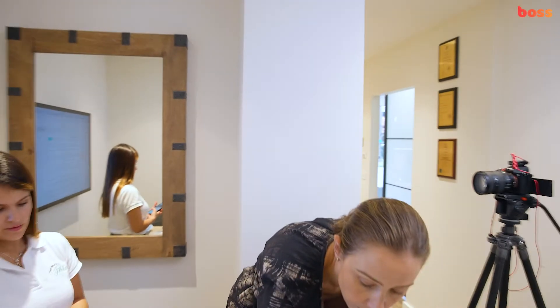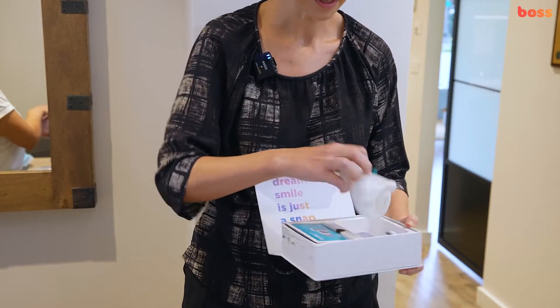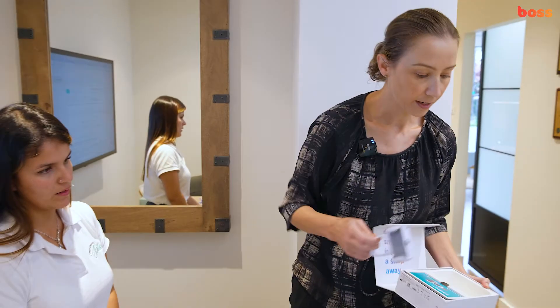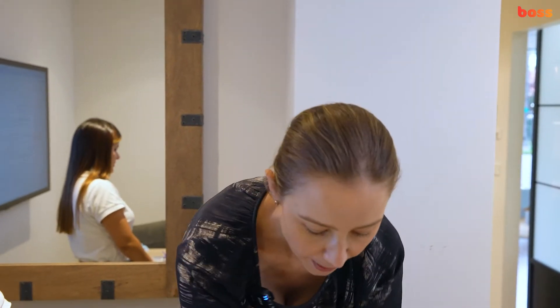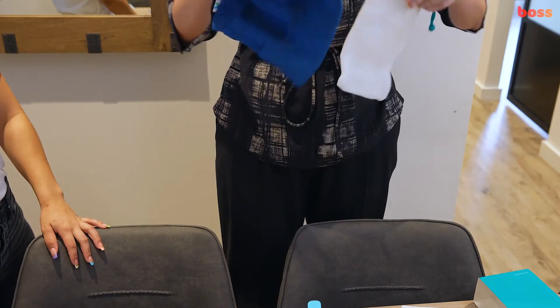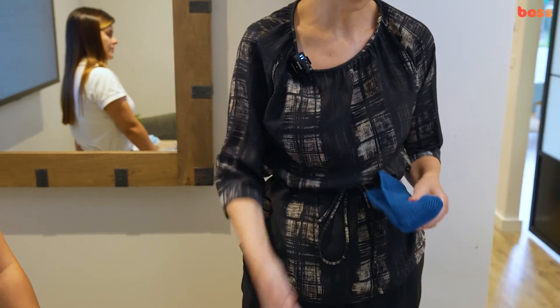I just wanted to show you what this particular scan box looks like — this is a new version. It's nice, small, and very compact. You can now see the difference in size: that's the original scan box and that's the new scan box. Even the packaging shows how much smaller it is. We've had a few patients and practices saying patients don't want to take the scan box with them when travelling because it's so big, whereas now there's really no excuse.